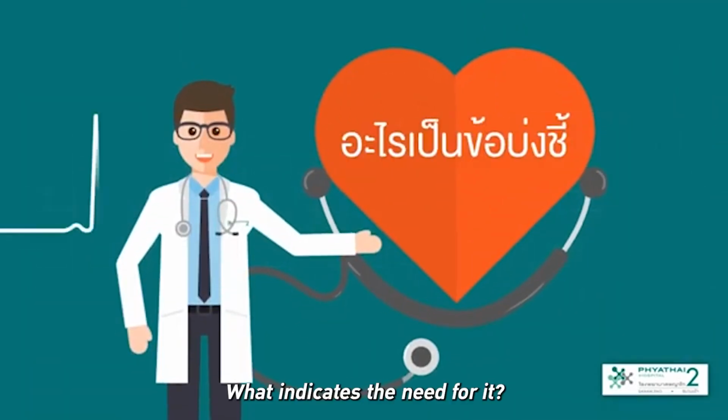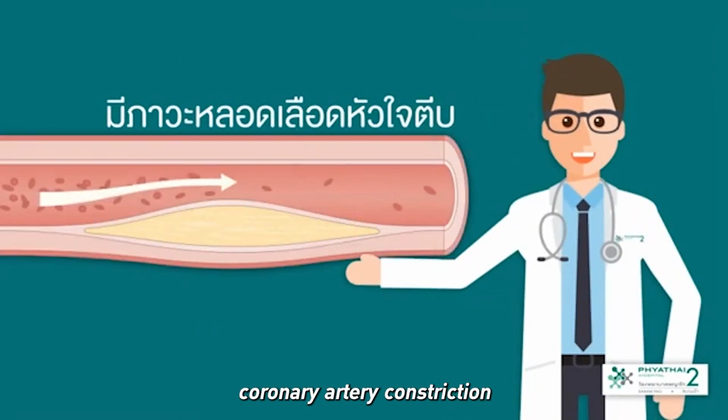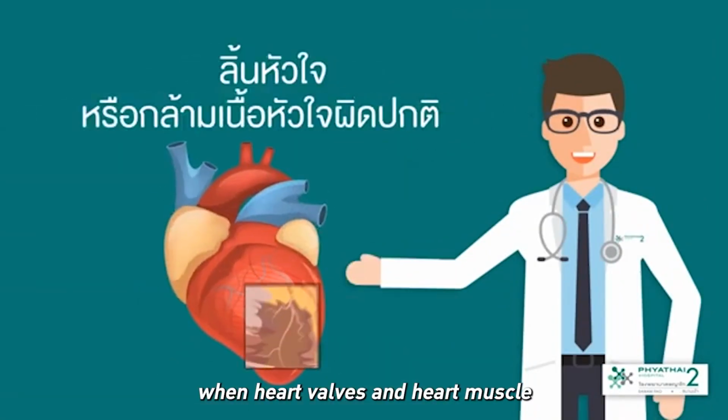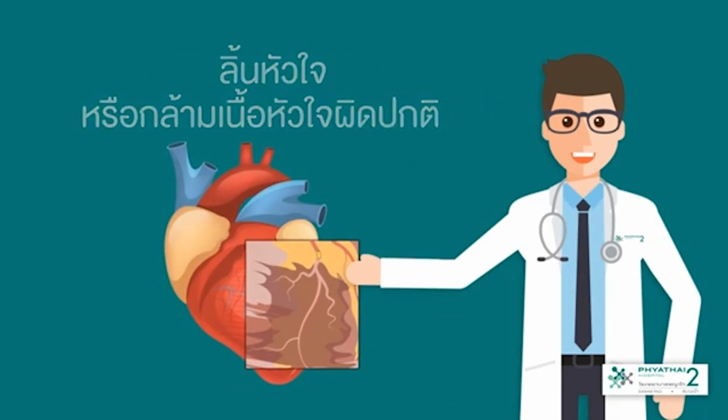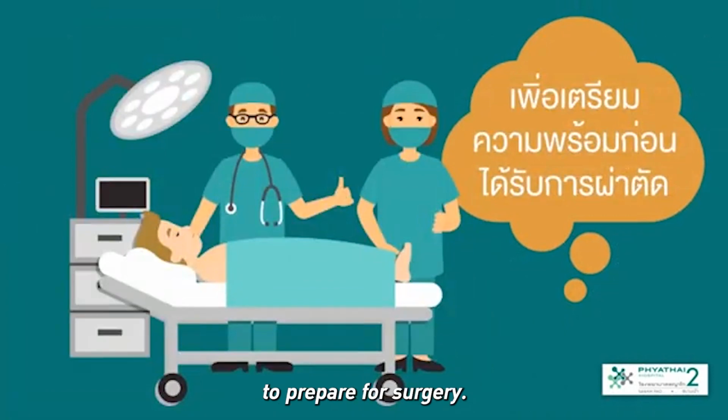What indicates the need for it? When doctors diagnose coronary artery constriction, when heart valves and heart muscle function abnormally, to examine the disease pathology of the blood vessels, to prepare for surgery.